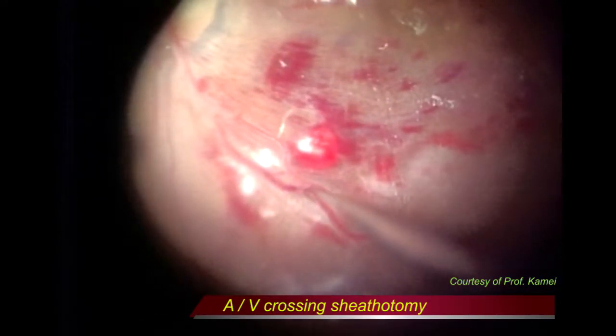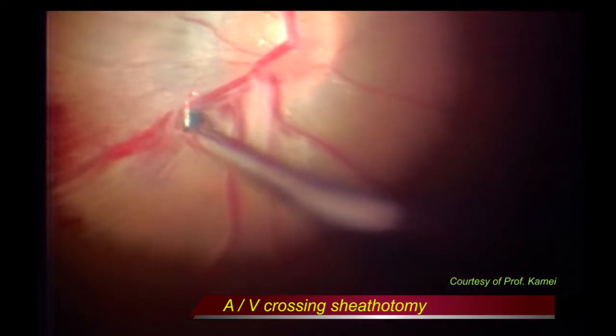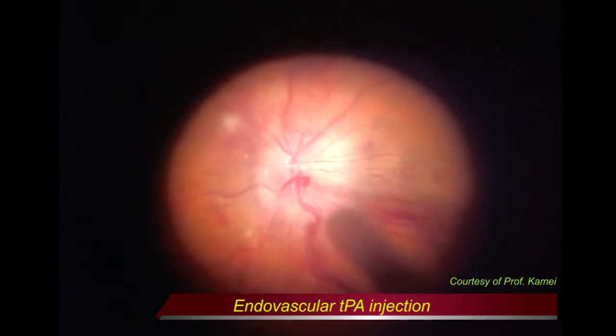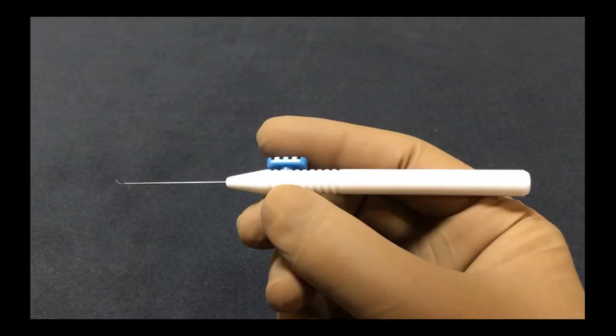Sheathotomy, a surgical decompression of the AV crossing, seemed promising, but it has shown limited effect. Micropipettes or microneedles have been used to directly inject TPA into the central retinal vein. These treatment modalities have been unsuccessful in the physical removal of the thrombi.